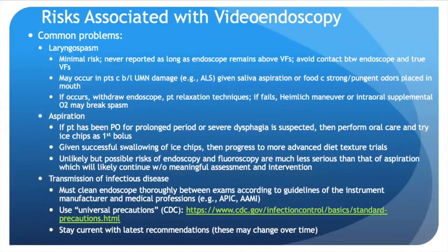Other common problems associated with FEES include laryngospasm. There is minimal risk of this. It has never been reported so long as the endoscope remains above the vocal folds. You'll want to avoid contact between the endoscope and the true vocal folds.